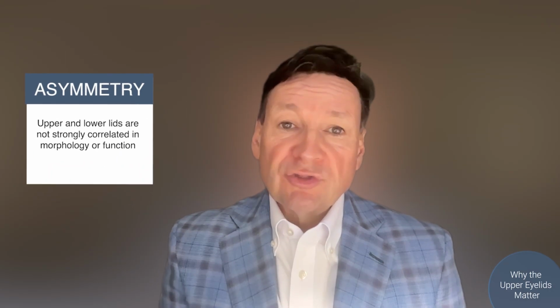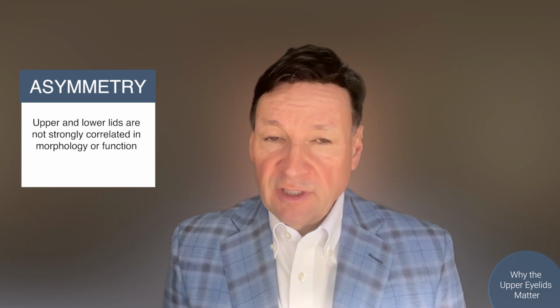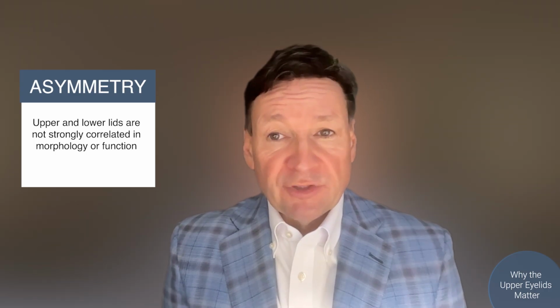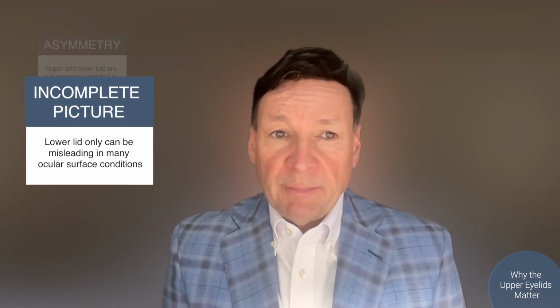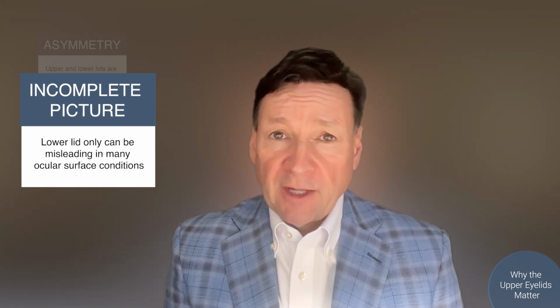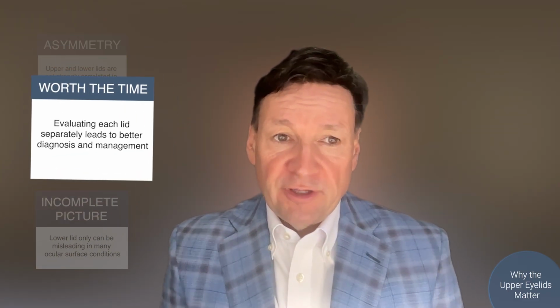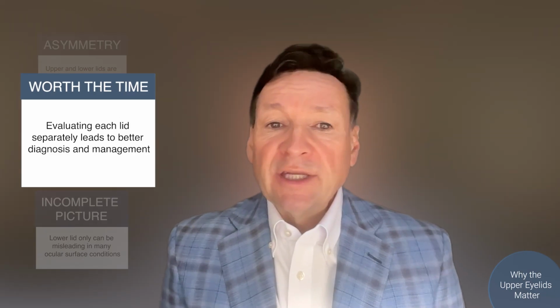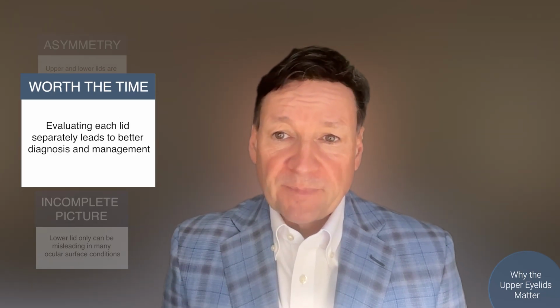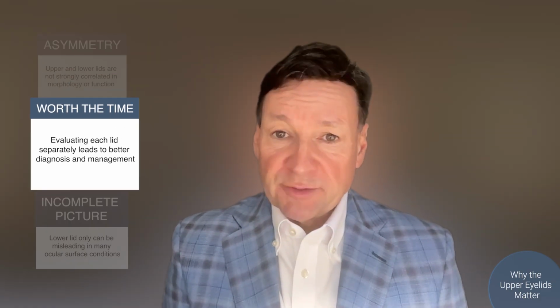Here are three key statements that frame our discussion, each supported by the literature. Number one, there is a lack of strong association between the upper and lower eyelids in terms of meibomian gland morphology and function. Changes in one lid do not reliably mirror changes in the other. Number two, because of these morphological differences, assessing only the lower eyelid provides an incomplete and often misleading clinical picture in many ocular surface conditions. Third, taking the extra time to evaluate each eyelid separately is worth the chair time. It leads to more accurate diagnosis, better patient education, and more appropriate management.